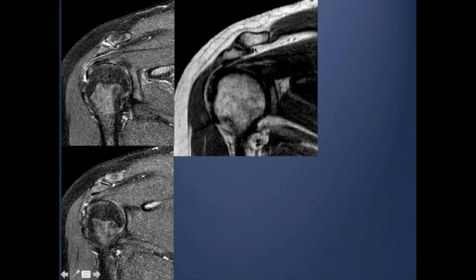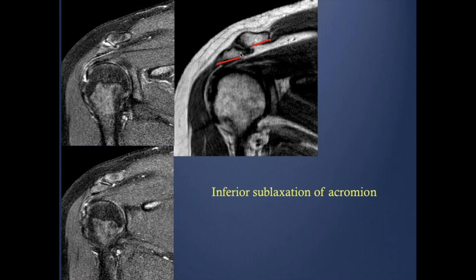The anterior part of the acromion is lower than the posterior part. Here you can see degenerative changes of the acromion. If you look carefully at the acromioclavicular joint, there is an offset — inferior subluxation — between the distal clavicle and the acromion. This is usually related to repetitive stress in weightlifters or previous trauma. We call it inferior offset or inferior subluxation of the acromion, which causes narrowing of the acromiohumeral interval and may result in impingement.